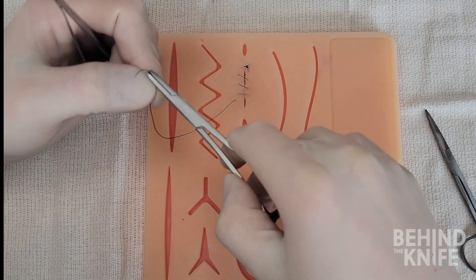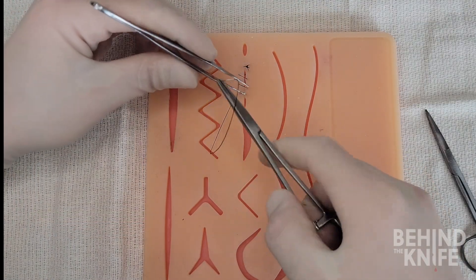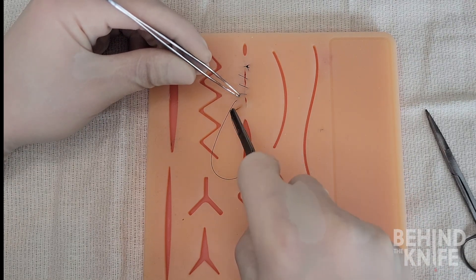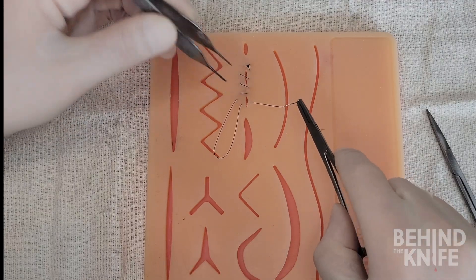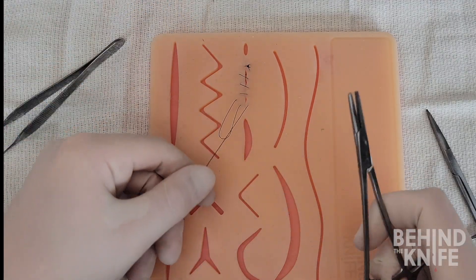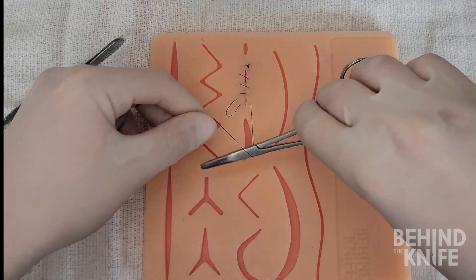For the final throw at the bottom of the wound we'll perform a backhanded simple interrupted throw. Instead of pulling the suture completely through as we've done previously we will leave a loop of suture material on the side of the incision opposite of the needle.